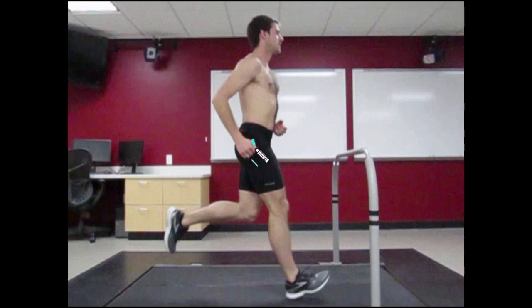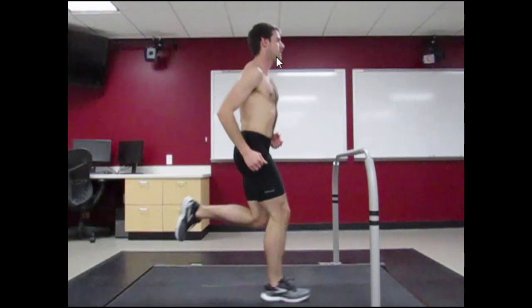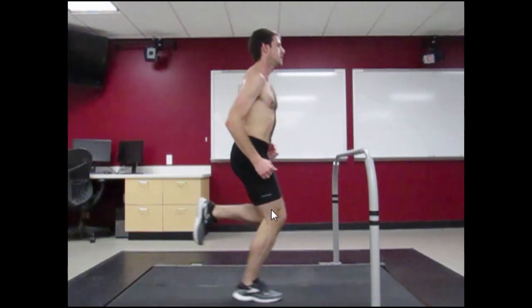In rear foot strike runners, the amount of knee flexion at initial contact is rather limited, with the angle being roughly 10, 15, maybe as much as 20 degrees at the point of contact. As we advance our gait cycle, notice the foot comes in full contact with the treadmill surface. Our center of mass reaches its low point at mid-stance. We have increased knee flexion all the way until this point.